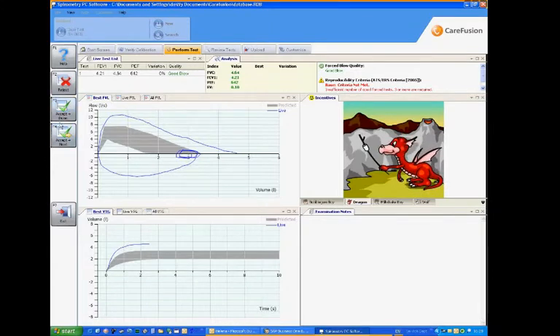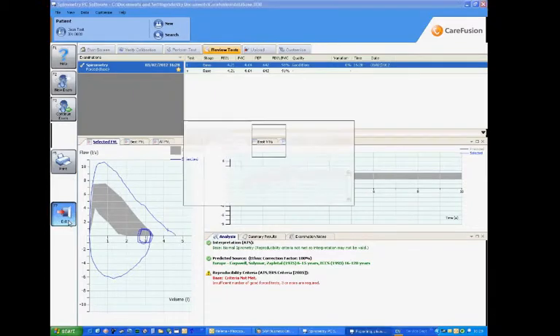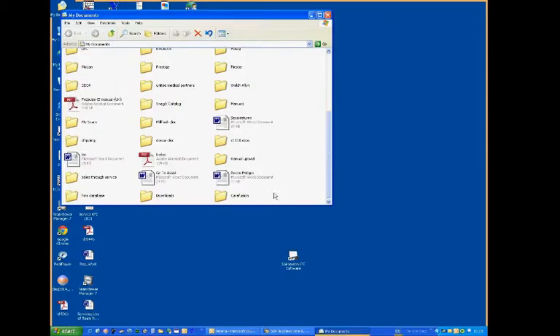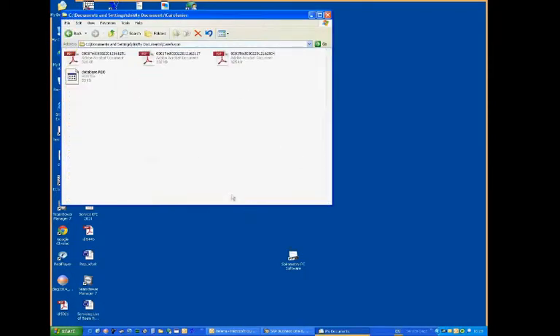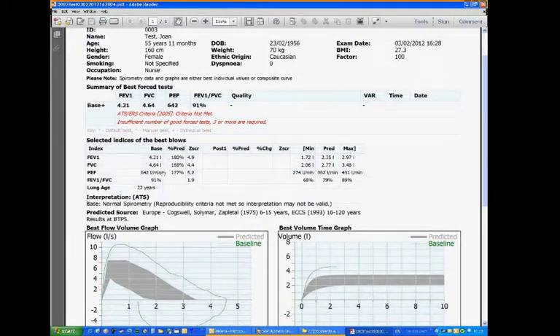And it will allow us now then to either print it off, or if we exit the software it will actually export that reading to a PDF file. I'm just going into the right folder — opened up my PDF file. And again this can be attached to your patient management software.